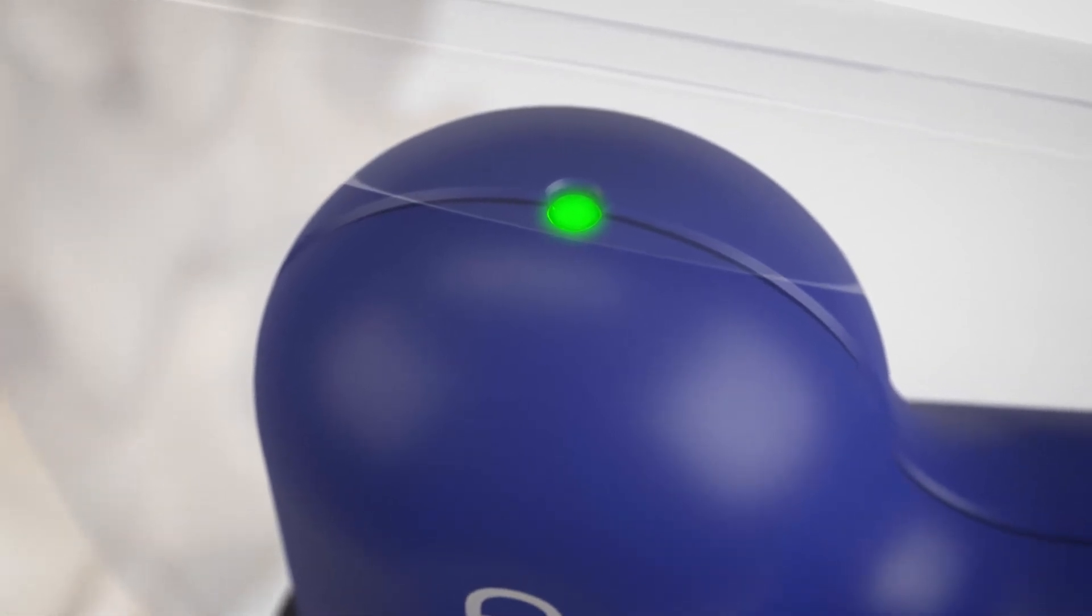The brightness of the LED indicator will display the relative speed at which the needle is rotating.